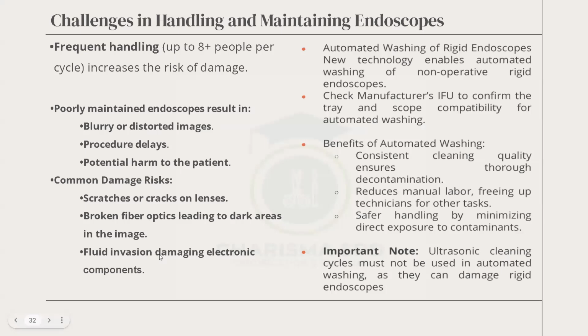Challenges in handling and maintaining endoscopes. Frequent handling, up to eight or more people per cycle, increases the risk of what? Damage. If a lot of people handle the scope, the chance is that one of us will cut corners or do the wrong thing.